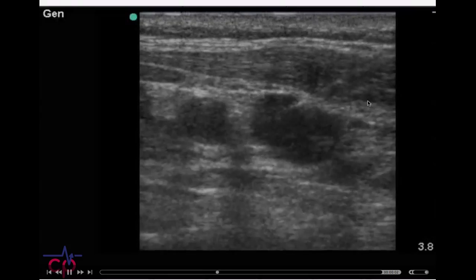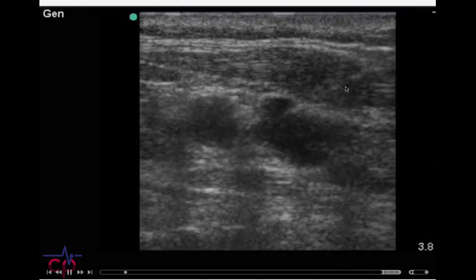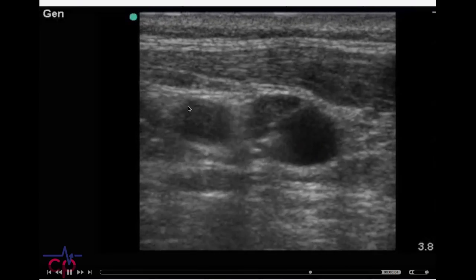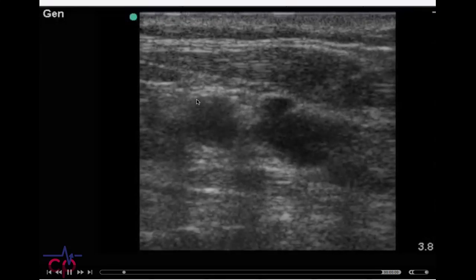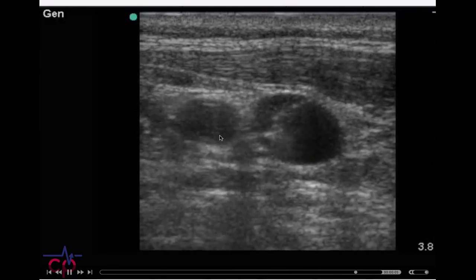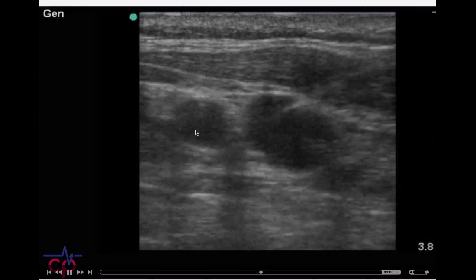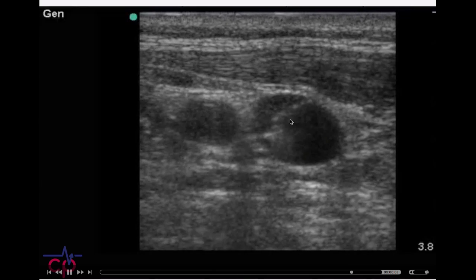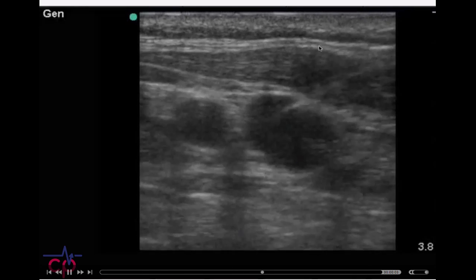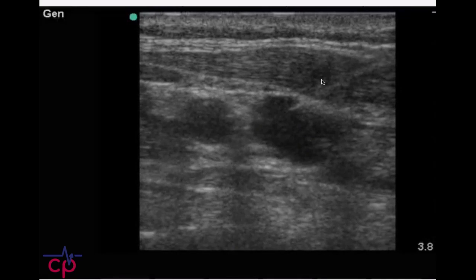In a real person, this is what it looks like — here is the needle inserted into the skin going through sternocleidomastoid muscle and penetrating into the IJ. What's nice is, as opposed to the dummy, you can actually see the other targets and avoid them. This is the patient's carotid right here — a structure we would not want to hit. But I can continuously visualize the carotid, the IJ, and the needle in its entire course if I stay nicely on axis with my needle position.